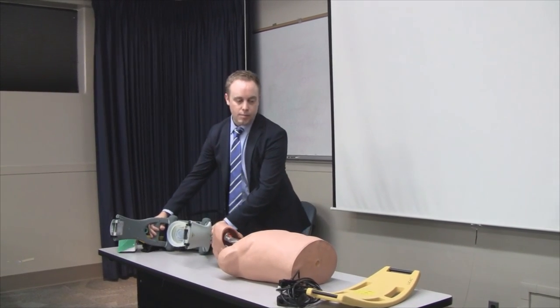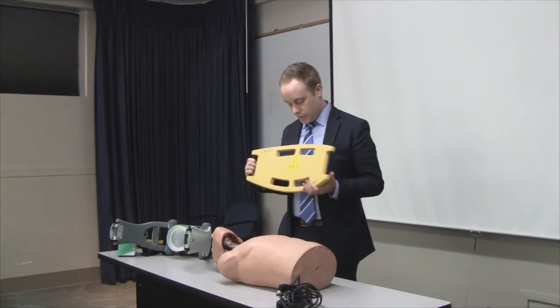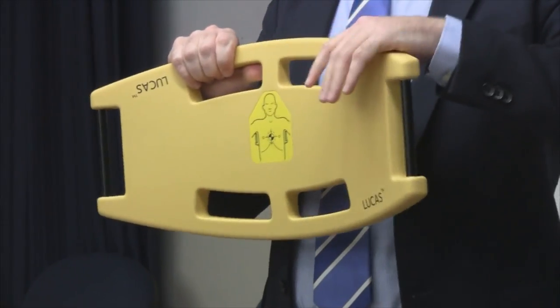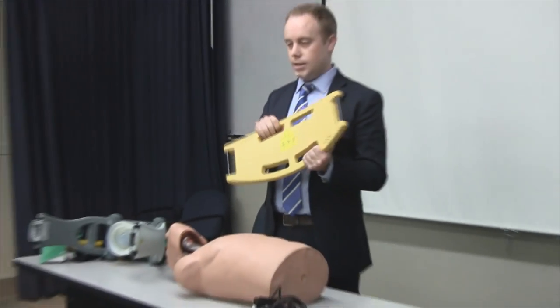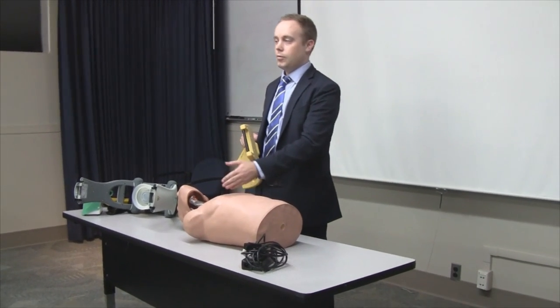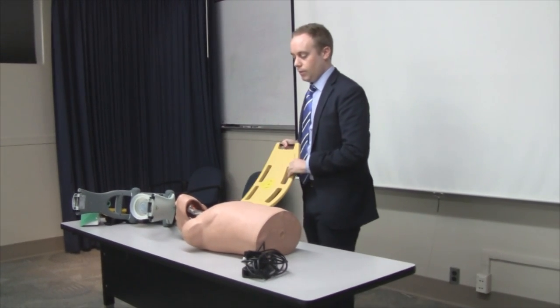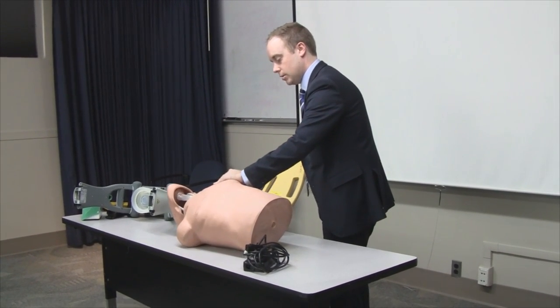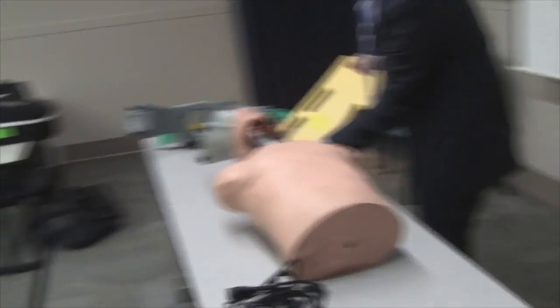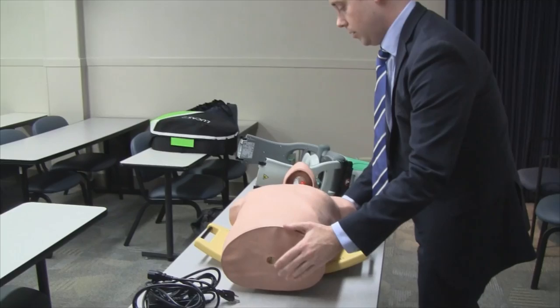To get started, there's a backboard to place underneath the patient. There's a diagram on here showing you want to align it with the top of the armpit, with the center of the backboard right underneath the sternum, in between the nipple lines — right where we would do compressions normally. You can either lift the patient and roll them to slide it under, or lift the head and neck and slide it in from the top.